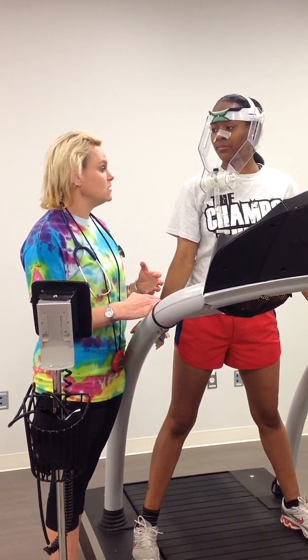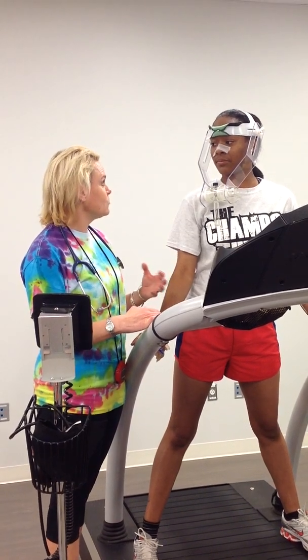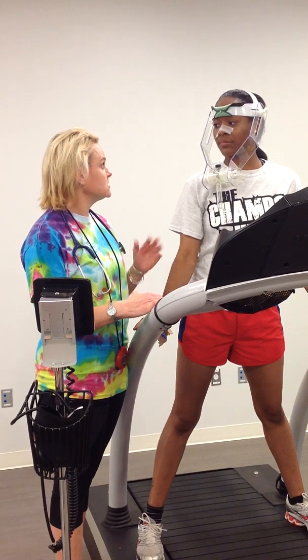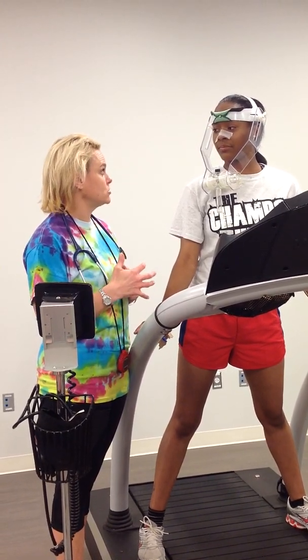During the test, we're going to be monitoring your breathing, we're going to be monitoring your heart rate, all those values, and we're going to be asking you how hard you think the test is. At the end of the test, we want you at a maximal level, so we want you to go as long and hard as you can.